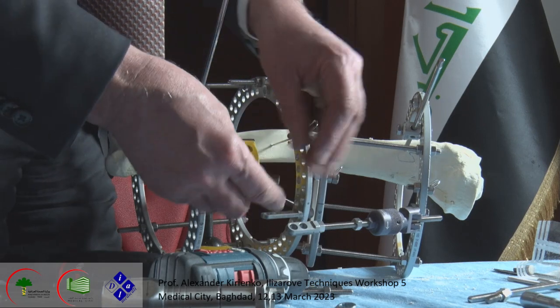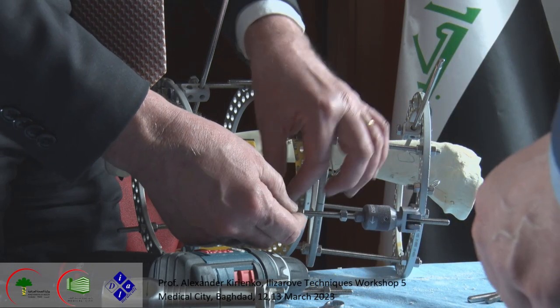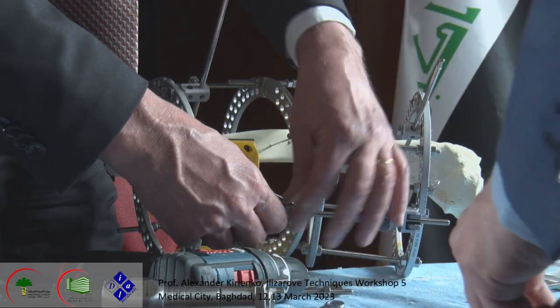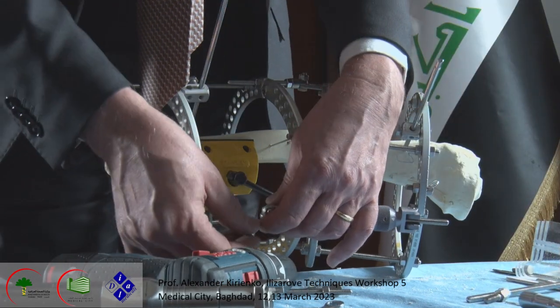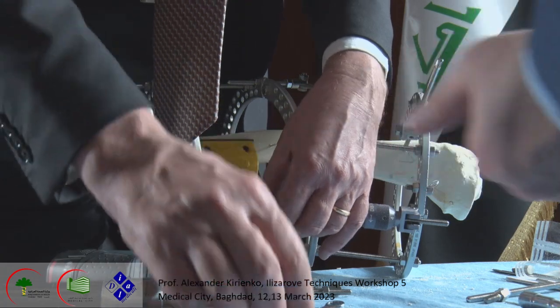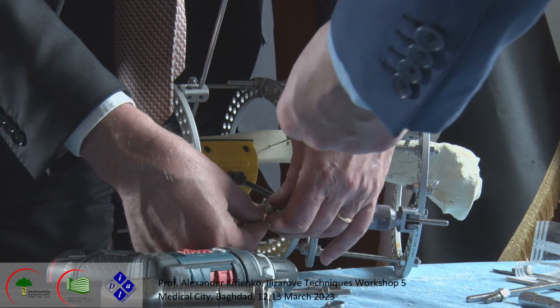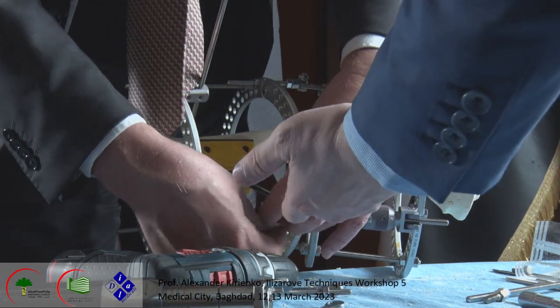We put this post, okay. And then we put again this bolt. And no, it is but a little bit longer. Okay. Yes. Like this.